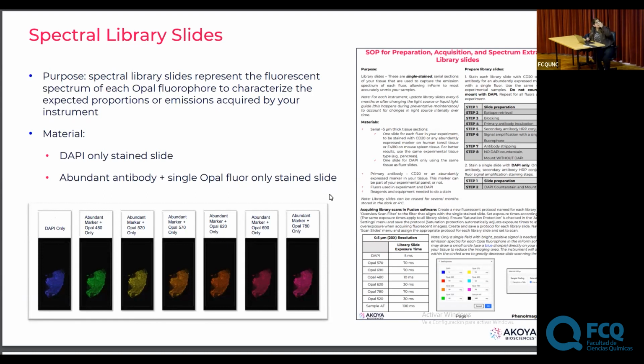What are library slides? They are slides that are stained with an abundant marker and one Opal dye. That way the instrument can capture the spectra of just one Opal dye. So it does not have DAPI.